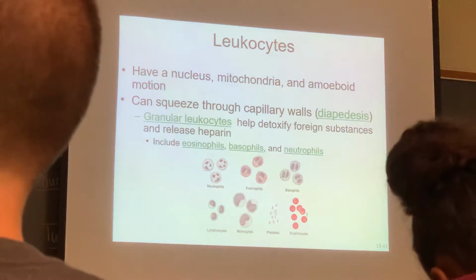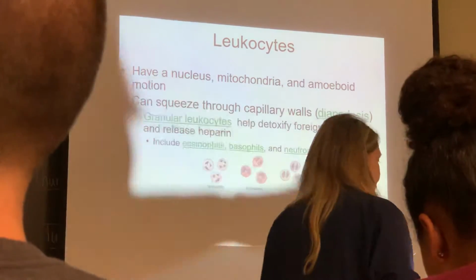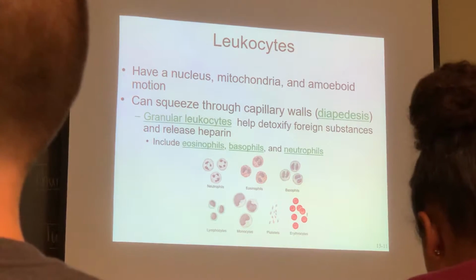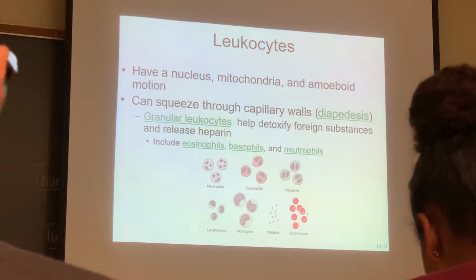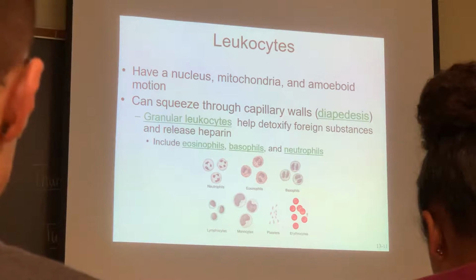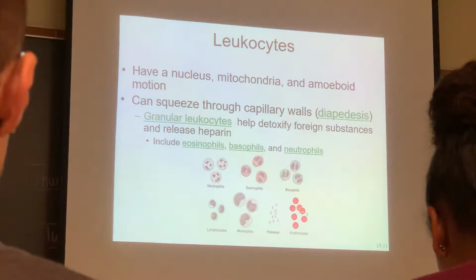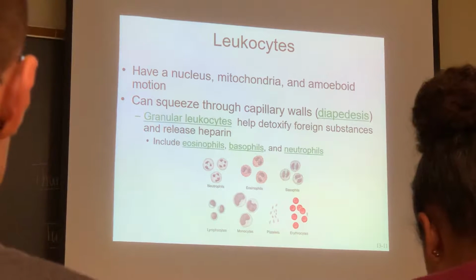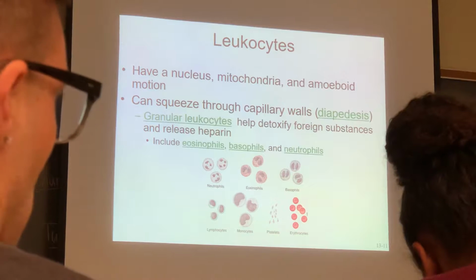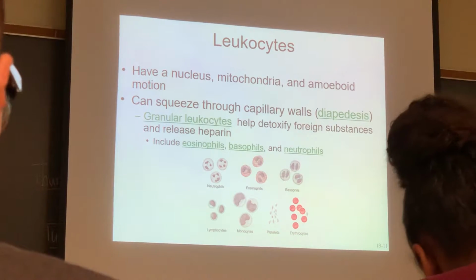So the neutrophil, again, is kind of a lilac-colored cell, and it has this nucleus that has many different appearances. We call that poly for many, morpho for appearances, nuclear for nucleus. So our nucleus is polymorphonuclear. They're not multinucleate. They have one nucleus, but it has multiple lobes.